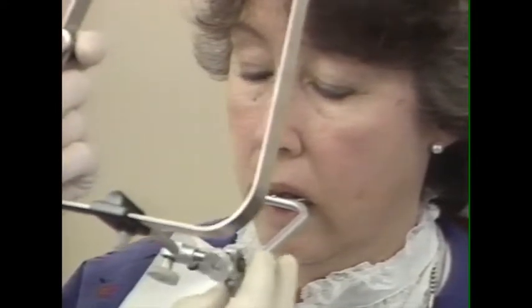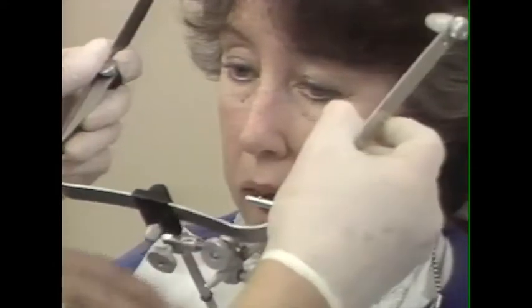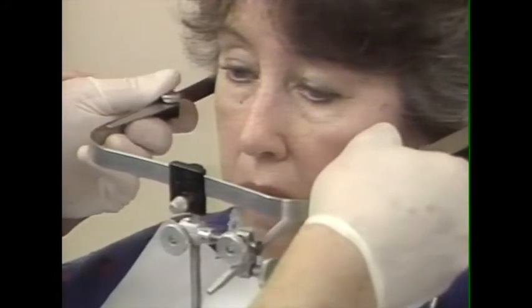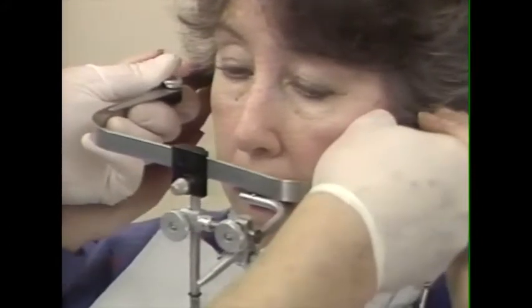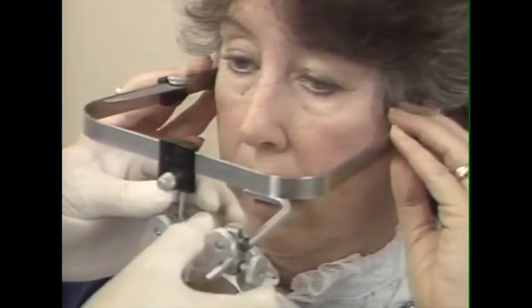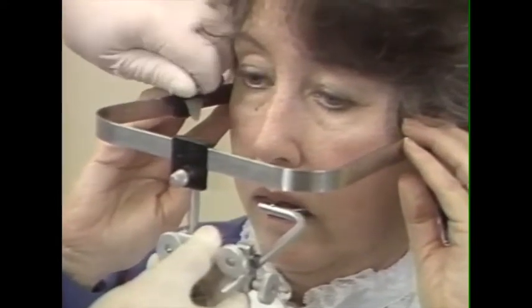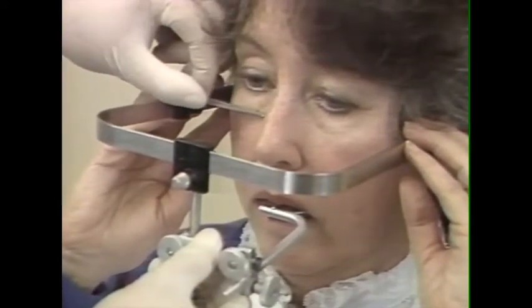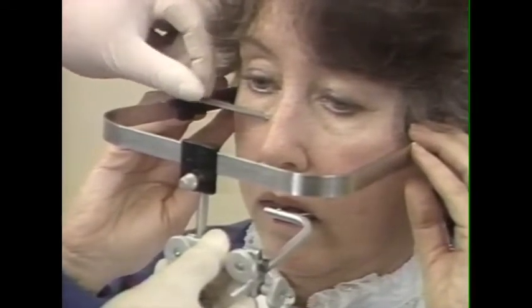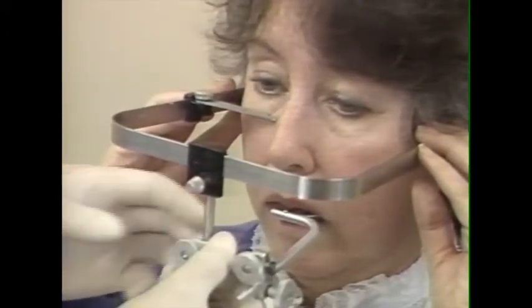We slide the number 3 clamp onto the bite fork and spread the ear rods. Have the patient help us insert them into the ears, like so. And then we elevate and lower the face bow until we can orient the infraorbital pointer to the axis orbital plane, which is a plane running through the 2 hinge axes and the infraorbital rim.